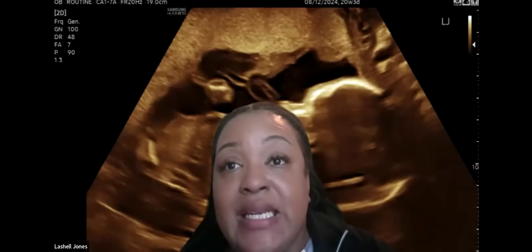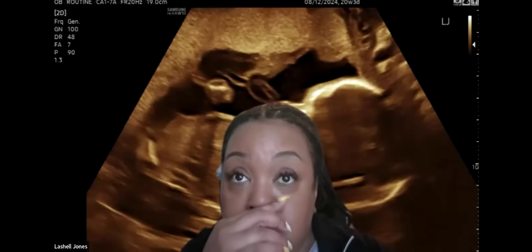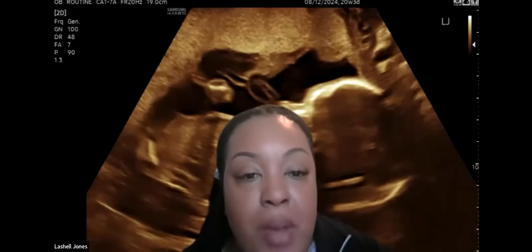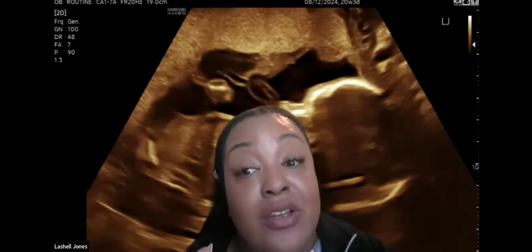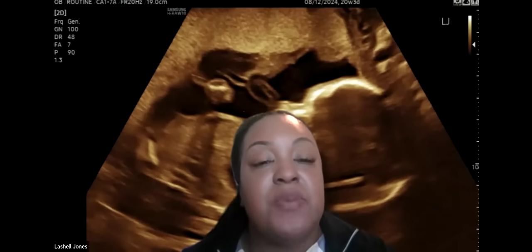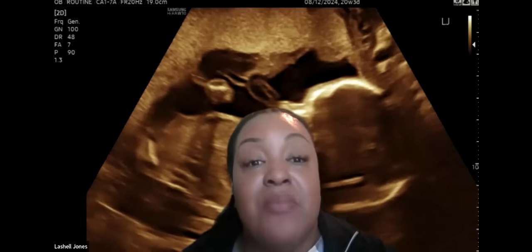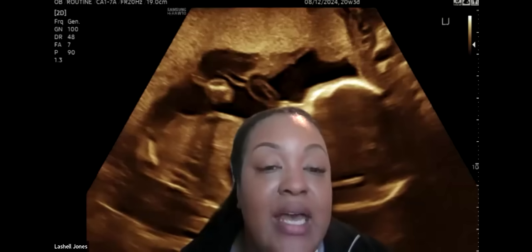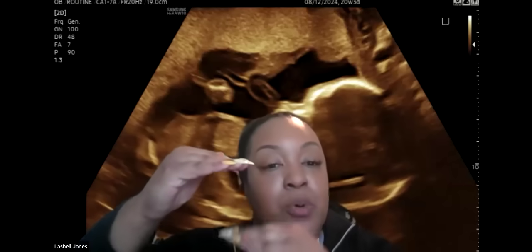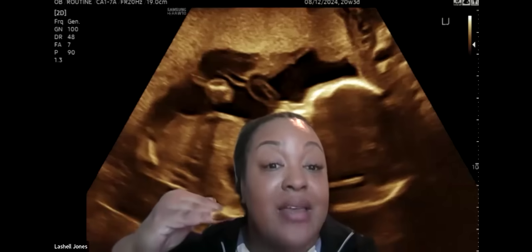Yes, we indeed set it in place, and I know some might look at that protocol and like, man, that is so many pictures. And you want to know the reason why we have that long protocol is because we missed a few things and we weren't routinely looking. And so it increased our protocol over time.